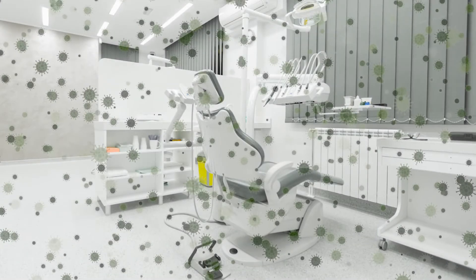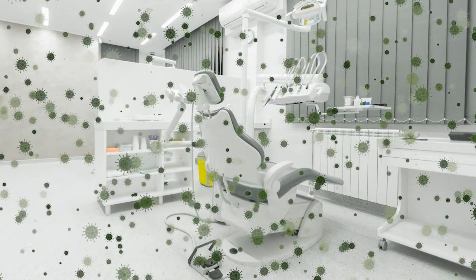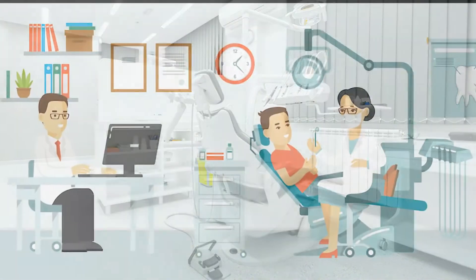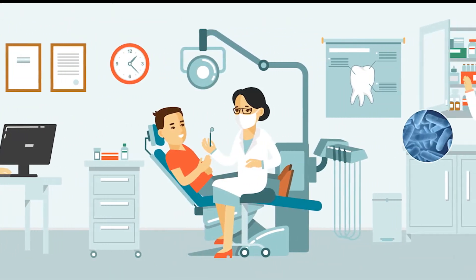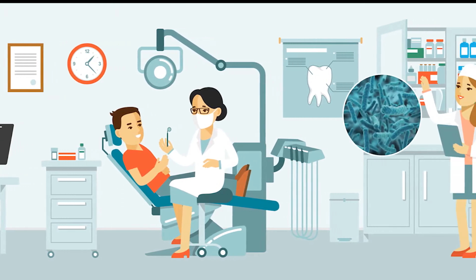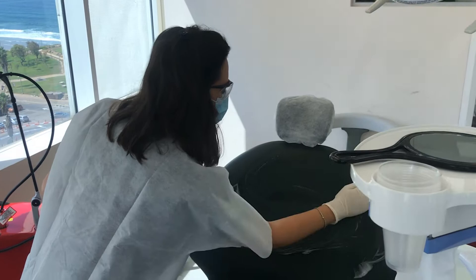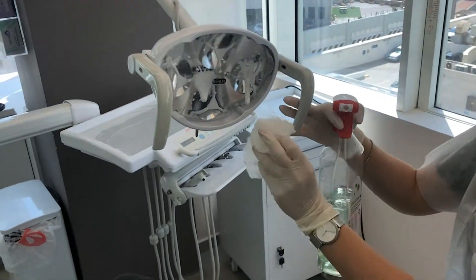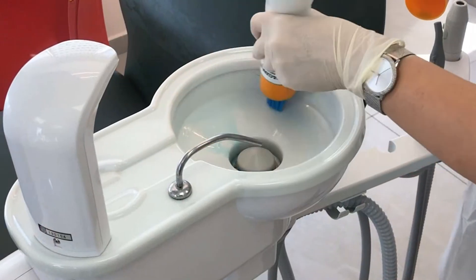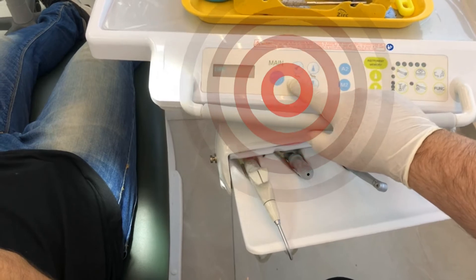Routine dental work involves constant exposure to infectious agents due to droplet spray during treatment. The operation surfaces, the dental unit, the floor and even the walls are all continuously exposed to infection by bacteria, viruses and fungi. Body covering, air filtration and standard surface disinfection can only handle this burden to a certain limit. Everything we touch becomes a potential source of infection.